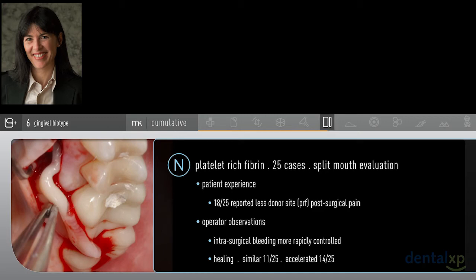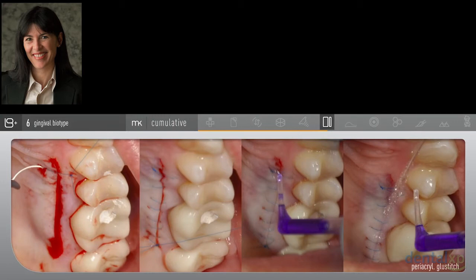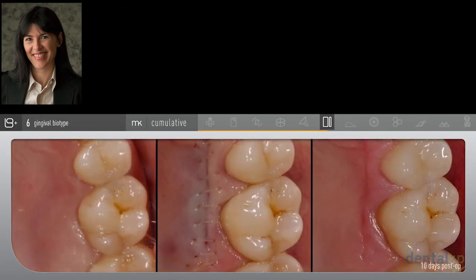So clean microsurgical techniques, doing things like building in autogenous growth factors or PRF might help. I'm not convinced it's the end-all and be-all, but I do see a little bit of pain reduction in the patients where I've actually used it. I'm trying to think about how I close, and I go back and forth with playing with different suturing styles, different materials, because I really do think that different sutures will have different outcomes for us. I'm using glue bandages, basically. I'm using adhesives, which literally protect the area as well. And my goal is to see this kind of healing.